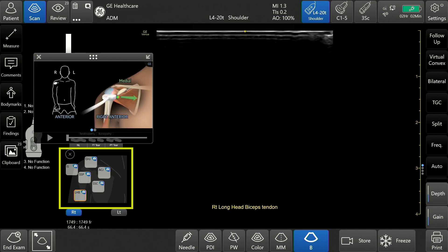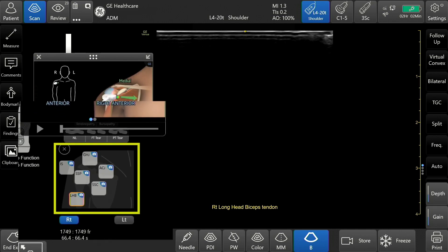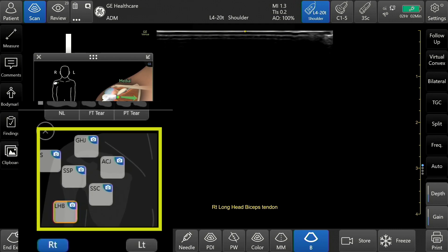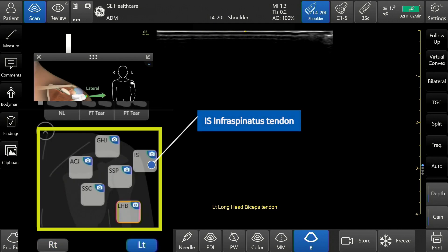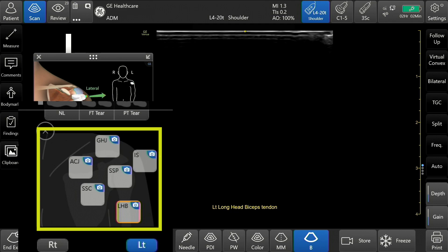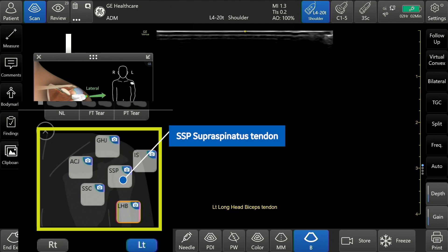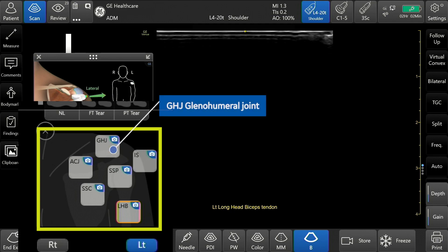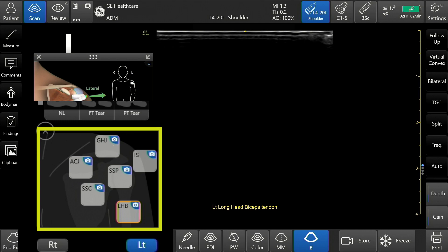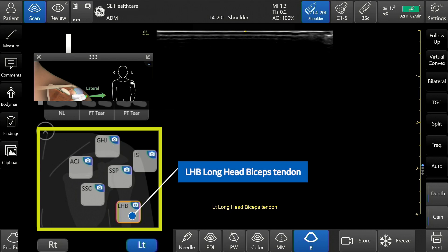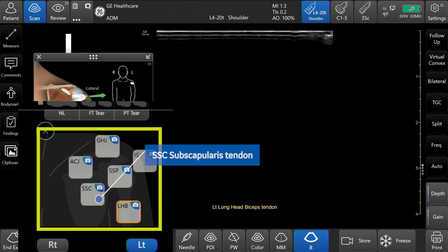Each side displays an anatomical diagram of the shoulder containing the following zones: IS (infraspinatus tendon), SSP (supraspinatus tendon), GHJ (glenohumeral joint), ACJ (AC joint), LHB (long head biceps tendon), and SSC (subscapularis tendon).